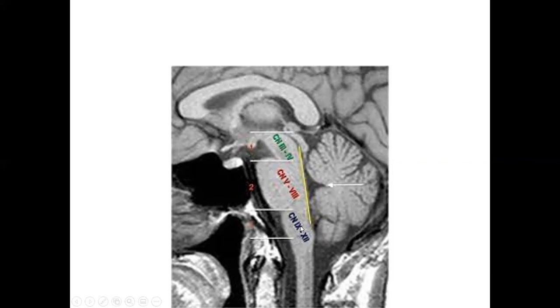You can see the fourth ventricle here. This is the tectum part, this is the tegmentum part, and this is the aqueduct of Sylvius that continues as the fourth ventricle. This is the cerebellar hemisphere.